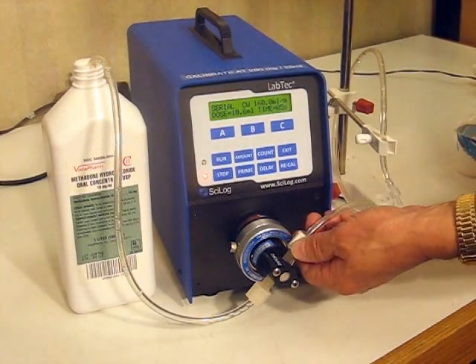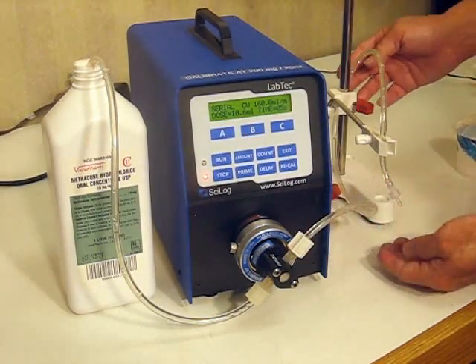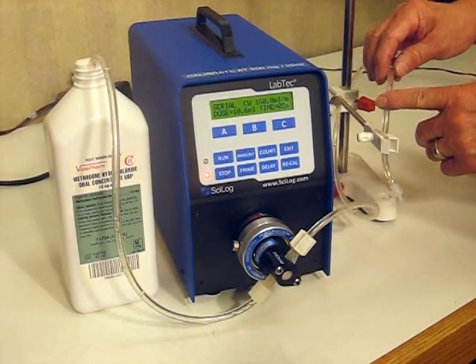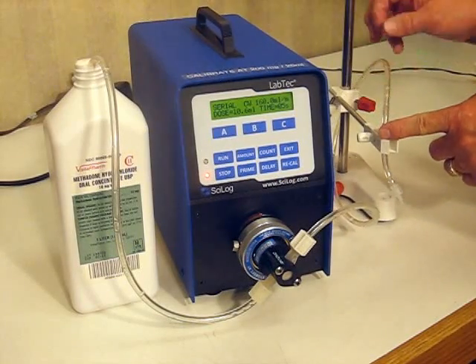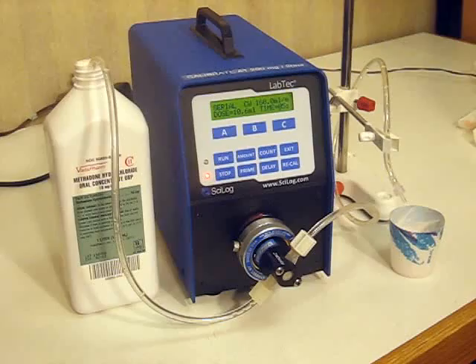On this side is the output, and the Methadone comes out of here and goes through the tubing. The dispensing tip is held by our standing clamp, and it is a hands-free dispensing.